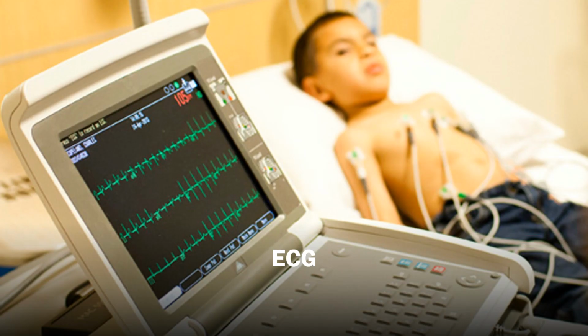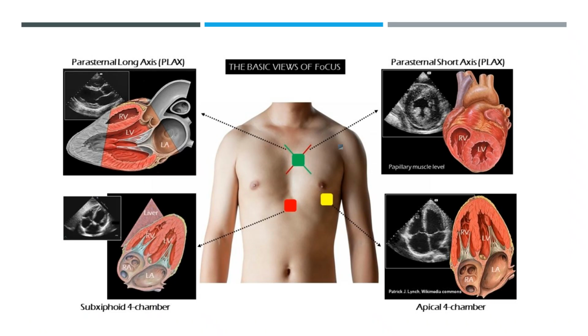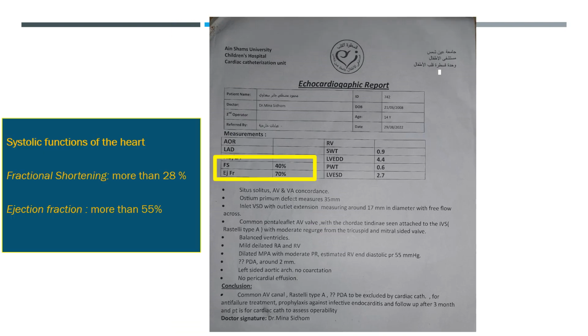For the ECG, it will be discussed in a separate lecture. And now we move on to the echocardiographic examination. The echocardiography views the heart from different acoustic windows with different views of the different structures to reflect any cardiac pathology. You must have a good understanding of the echocardiographic report, as you will see it in almost all patients following up in the cardiology clinic.